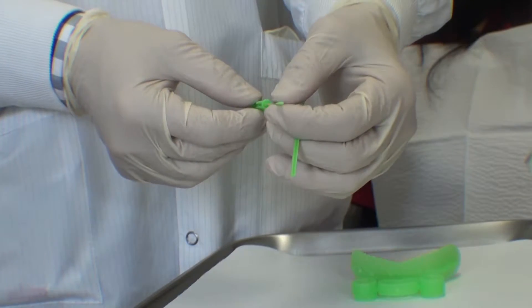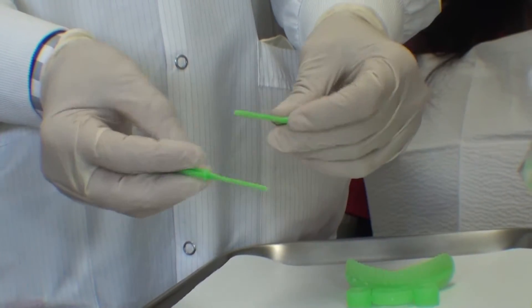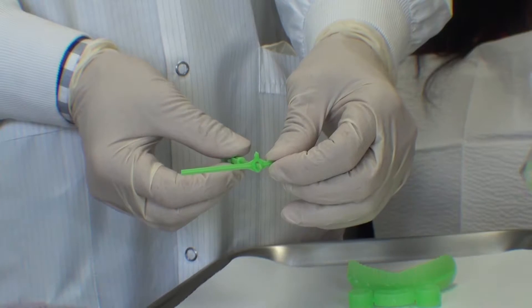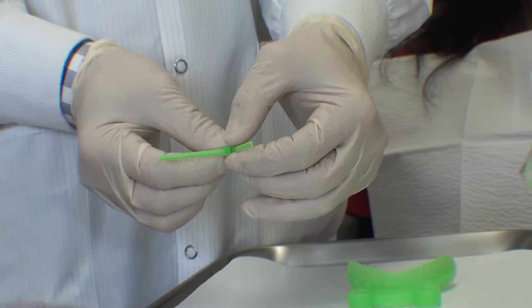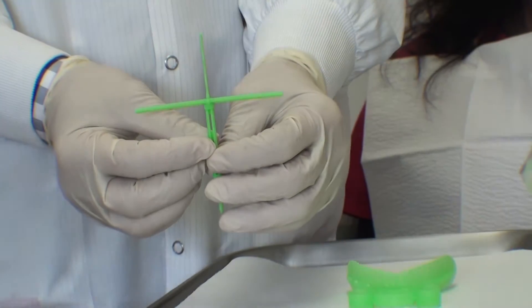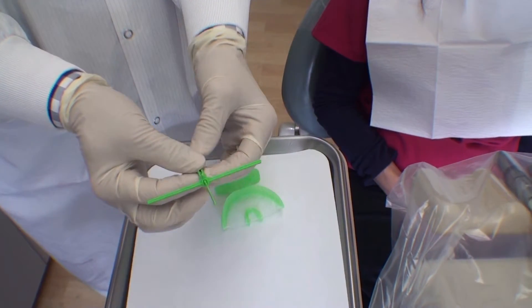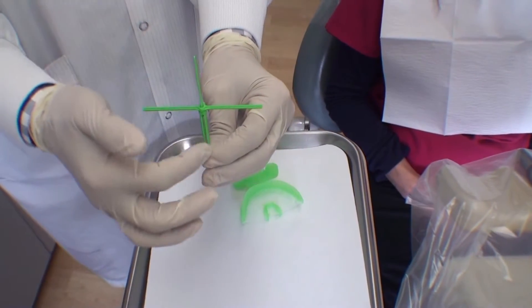One of the sticks has a flat end and a round end, and the other one has a hole. What you want to do is to insert the flat end all the way up until it snaps into place, which forms a cross. Make sure it's positively seated and that the cross exhibits 90 degrees.